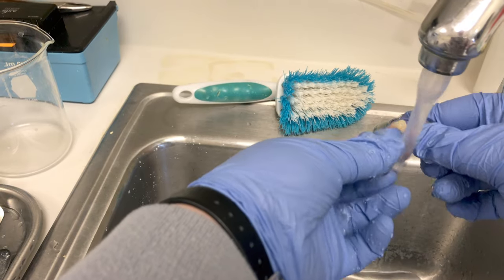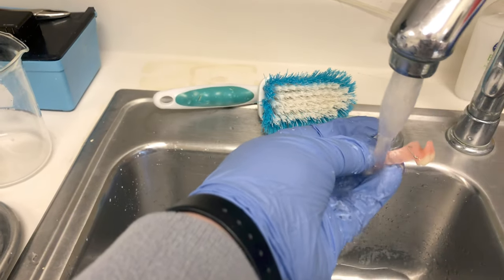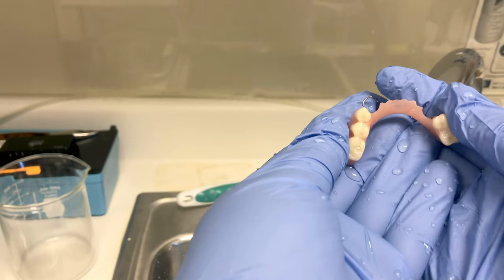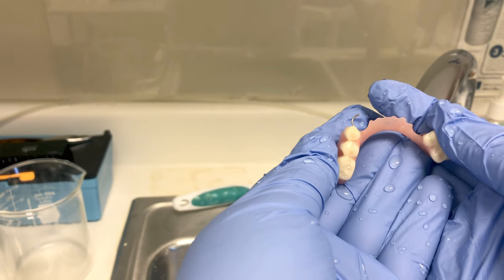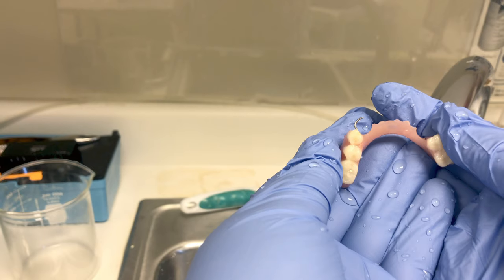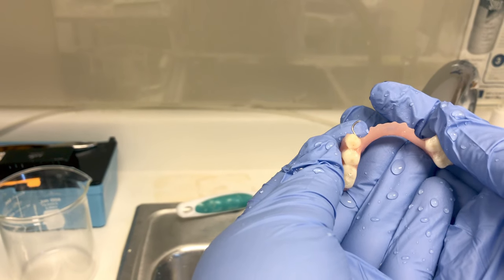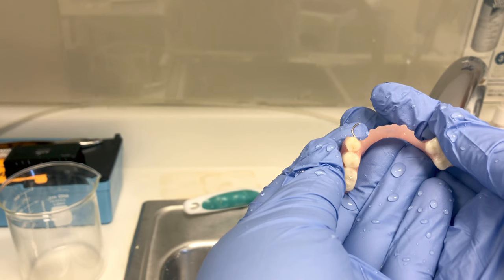Rinse the item thoroughly and then we're going to put it into a plastic bag. We're going to use the ultrasonic cleaner to loosen up the really tough stuck-on debris. I can't just put the patient's appliance directly into that ultrasonic cleaner — all the patient care items for the day go in there, so that would make the appliance very dirty.